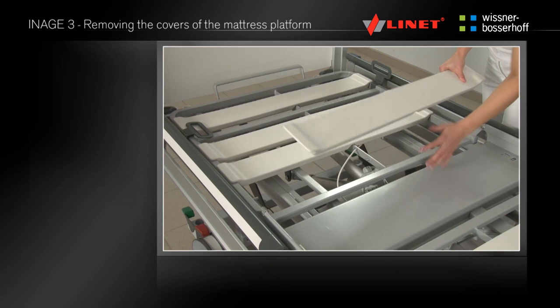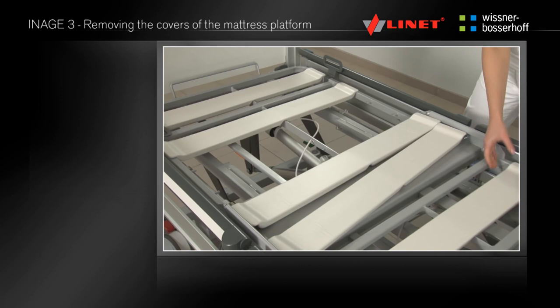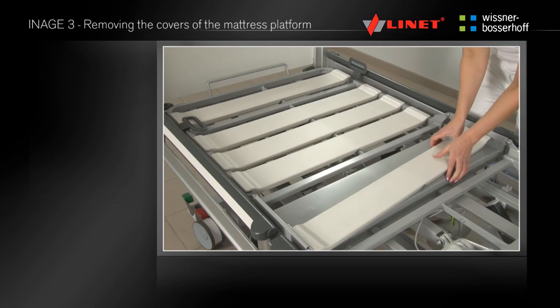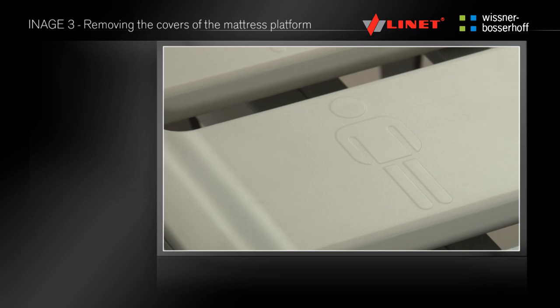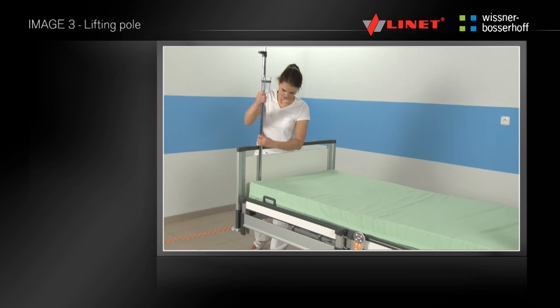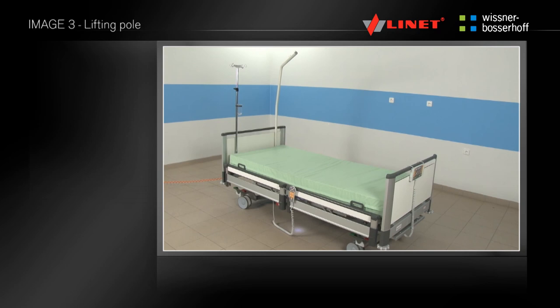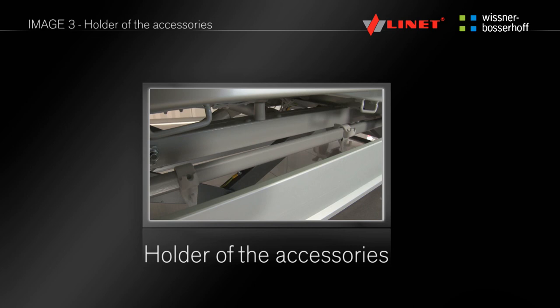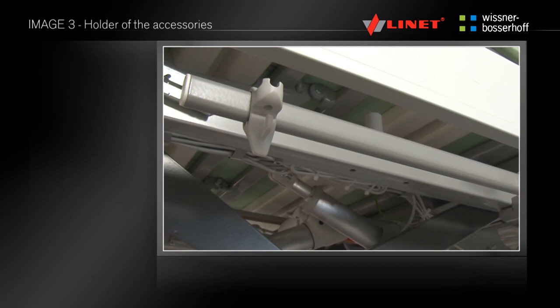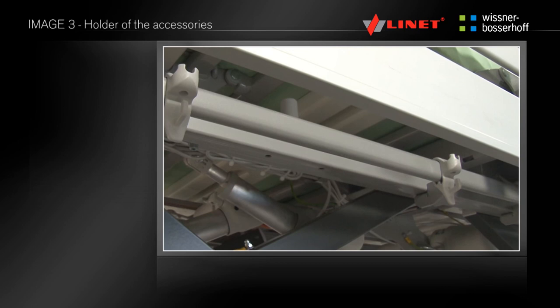The mattress platform is equipped with eight removable plastic covers for better cleaning. The covers are not fixed and can be removed without tools. A symbol of a stick figure on the edges indicates the correct orientation. The covers are interchangeable and can be used anywhere on the bed. Use the casing at the head end for placement of the lifting pole or infusion stands, ensuring the safety pin fits into the slot. Small accessories weighing up to 2kg can be placed on the sliding plastic hooks on the rails beneath the mattress platform, with a total rail capacity of 10kg.